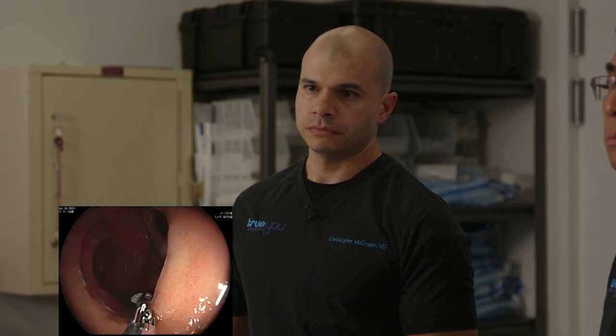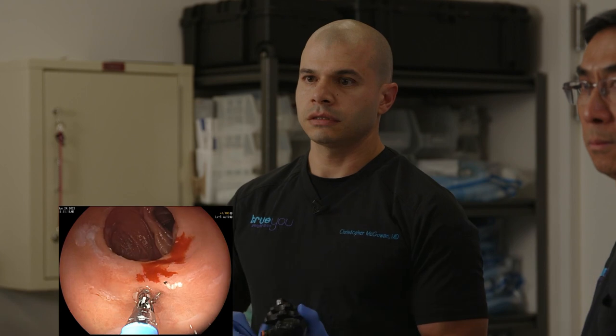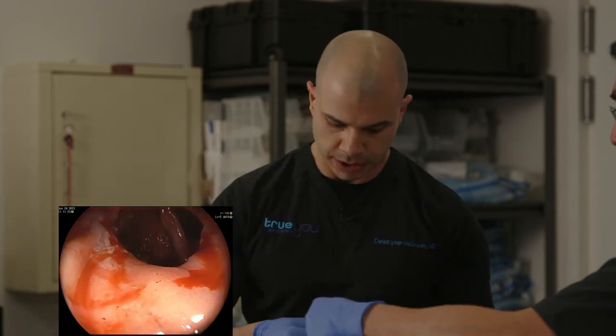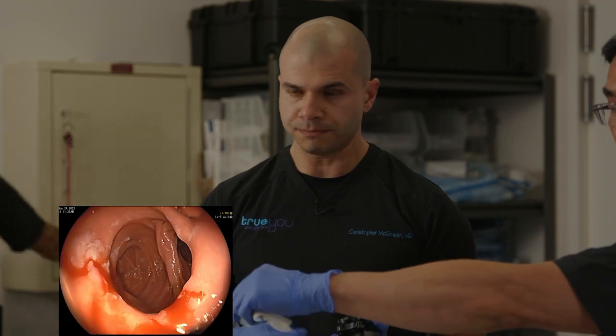Close here. All right, so that's removed. And we'll go ahead and take that out, and then I'll take the second one out. So this wouldn't really interfere with our procedure today, but we're going to tighten down this outlet quite significantly, and we don't want those staples to cause any issues with that smaller opening down the line. And this is totally safe to do. These staples aren't doing anything at this point.